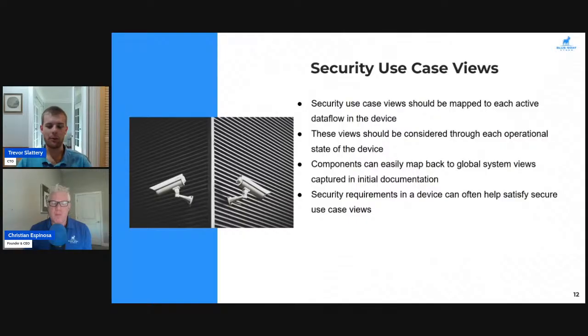It's a legacy requirement for the DICOM format that leads to all sorts of risk in devices. So considering things like that, verifying that it hasn't been tampered with, verifying that it hasn't been used in a risky way, verification, input validation, those are the main things that we should look at when we're addressing security and data flows.